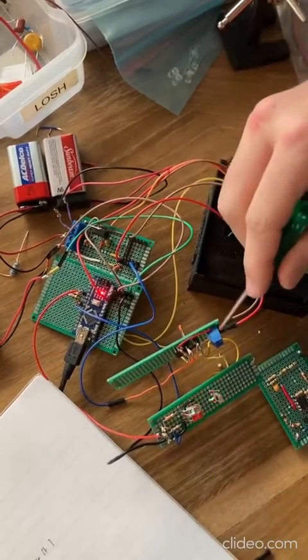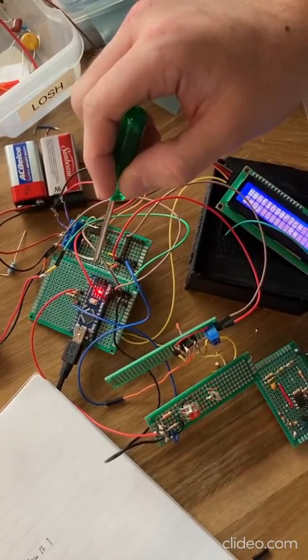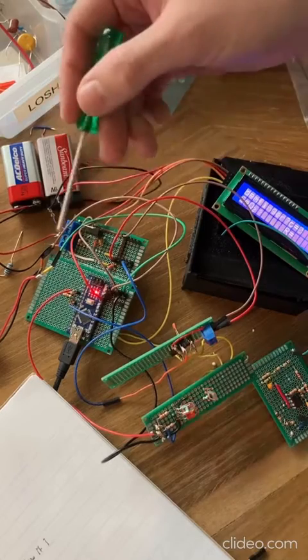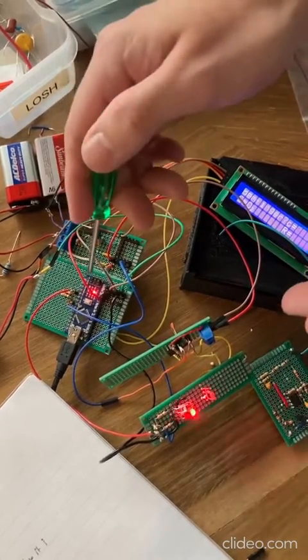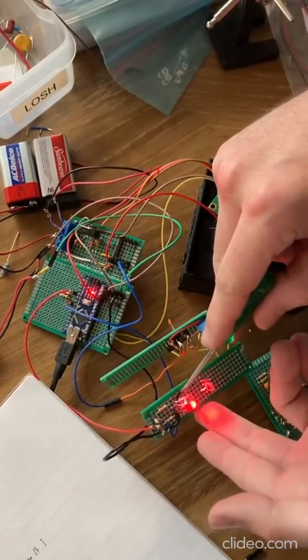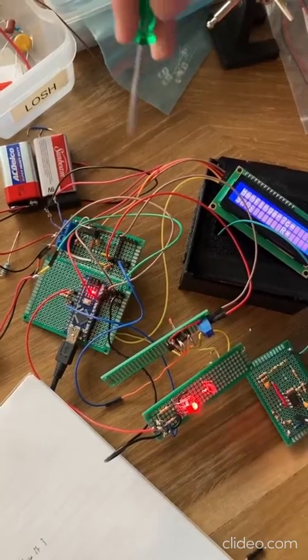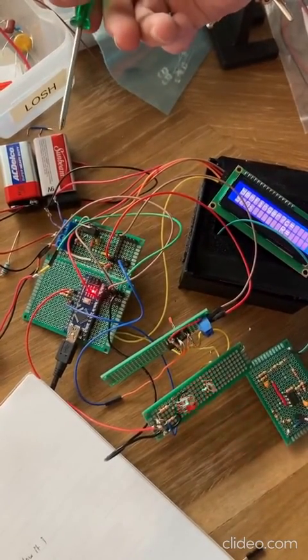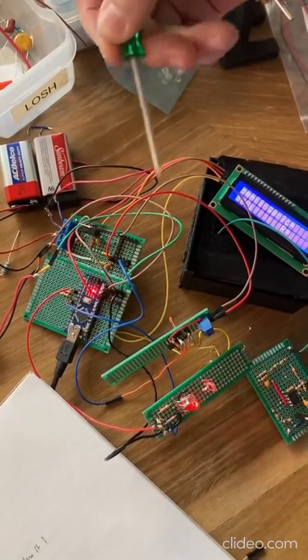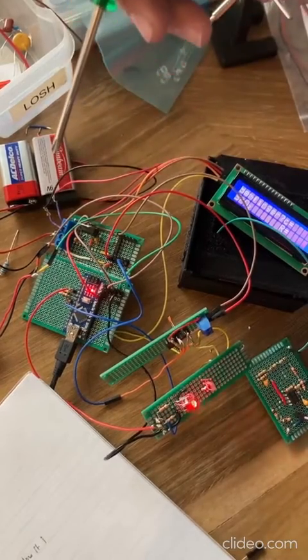Okay. After the voltage source goes into the ADC with this wire, the microcontroller will take a sample, and it'll convert that sample into a current. It will mathematically turn it into current, where it will then be able to take the ratio of the current from the IR LED to the red LED and able to find the peaks, which will allow us to determine the R value, which is the ratio of the oxygen concentration. And because we're detecting the peaks as well, we'll also be able to get the heartbeat.